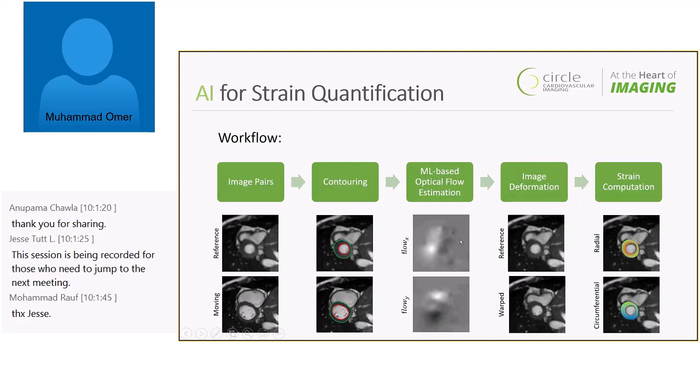And again, with that flow estimated, we can put that into a strain calculator to compute strain in both radial and circumferential directions. And then further analysis or strain-based diagnosis can be performed on these numbers.